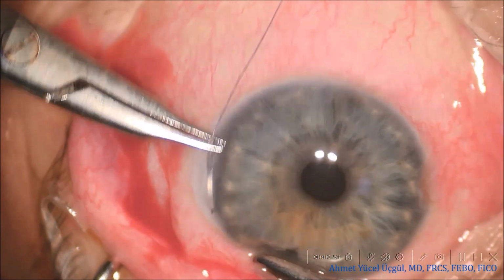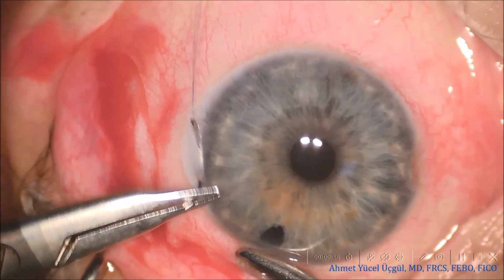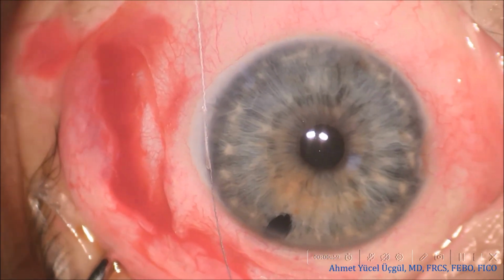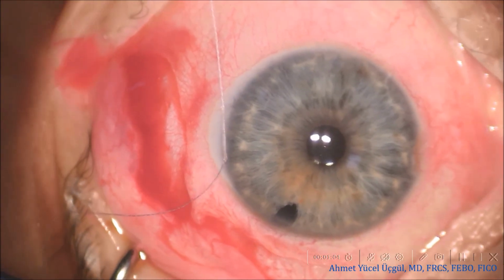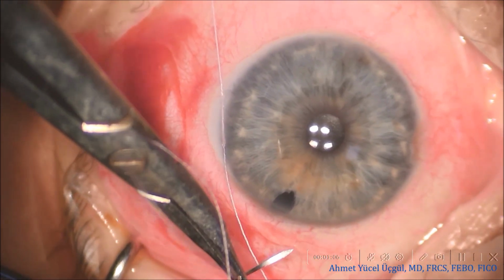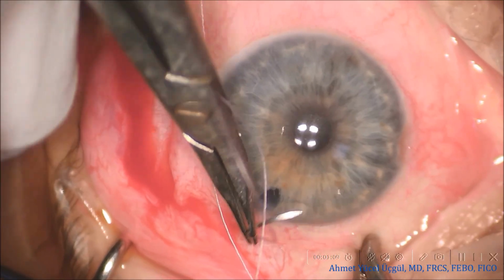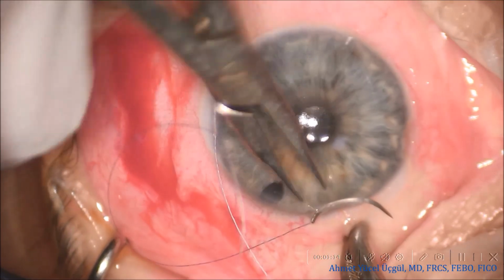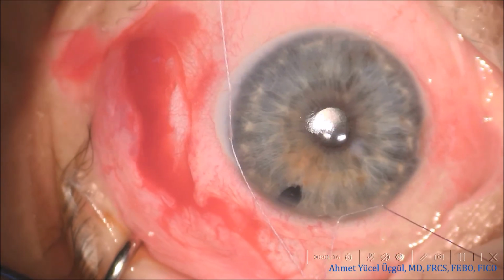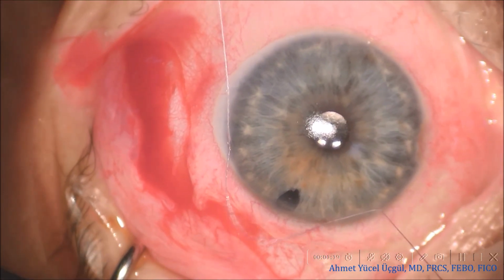6-0 Vicryl traction sutures are then passed through the peripheral cornea. The advantage of using two sutures is that the traction force is shared between two different entry points rather than being focused on a single area. This provides more balanced globe rotation, better surgical exposure, and more stable control during posterior dissection and plate positioning.